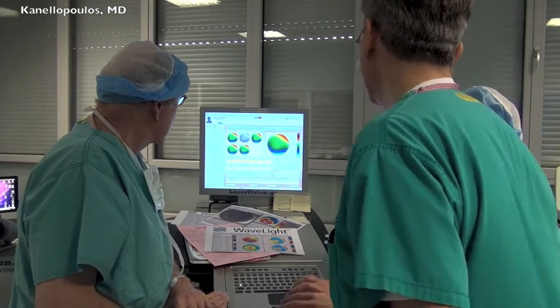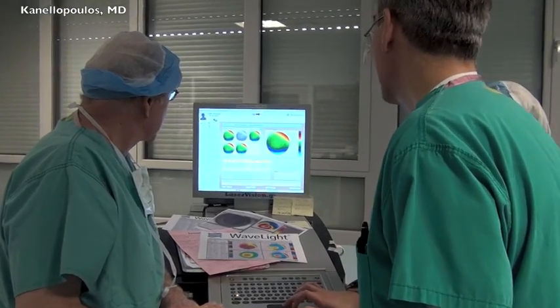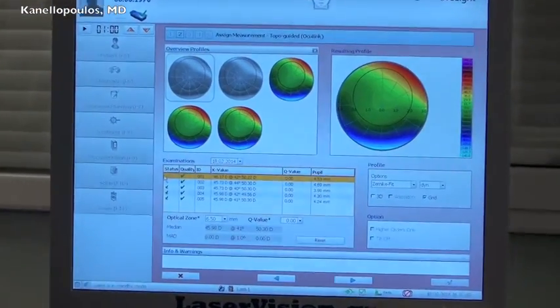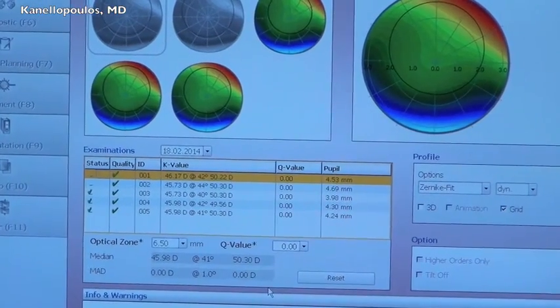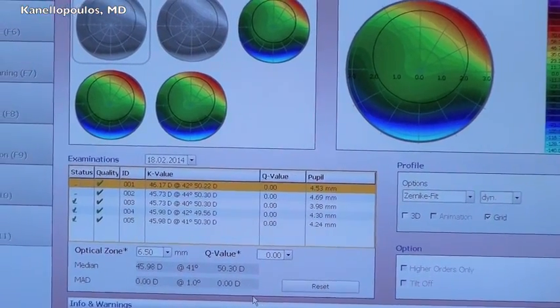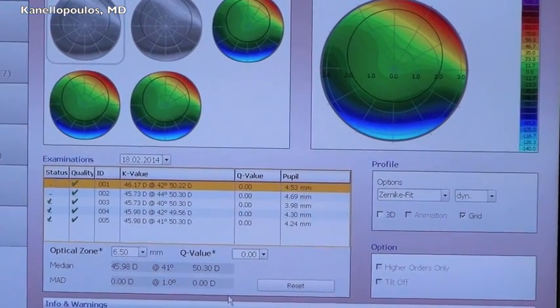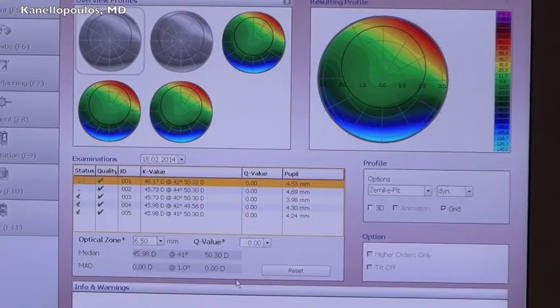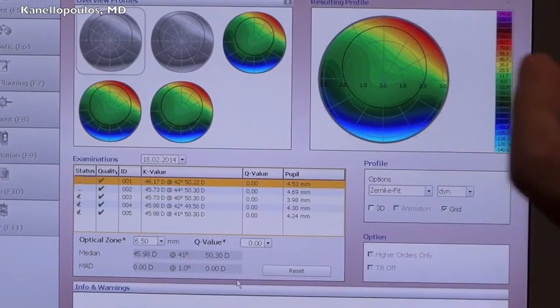So let's do that again. Alright, so now let's feed this into the device. We're going to ask it to... Let me ask one more question. Sure. Would you ever consider just averaging the 5? It will do so if you leave it as is, it will average the 5. That's what it will do. But you want to get rid of the outlier.